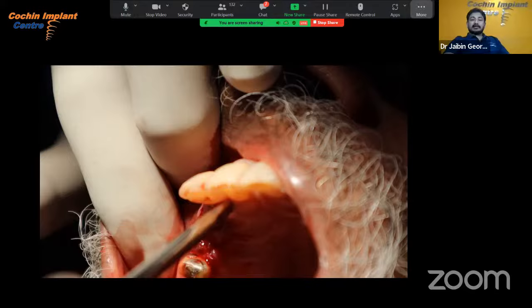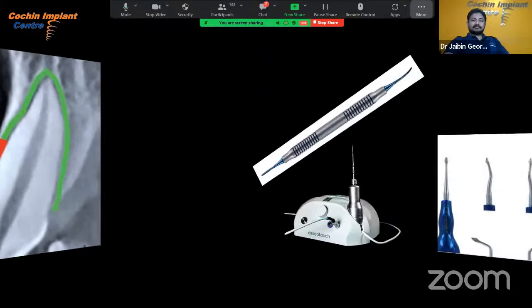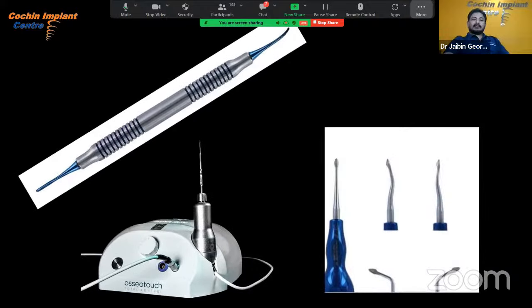We want to preserve the labial bone, the bundle bone, which is very important, which is a part of the periodontium, and it is very thin. If you break the bundle bone, it is difficult to place and load an implant immediately. So whenever possible, we try to preserve the bundle bone by doing a less traumatic extraction. These are the gadgets which we use for less traumatic extraction. We can use a periotome, luxators, or a magnetic mallet.